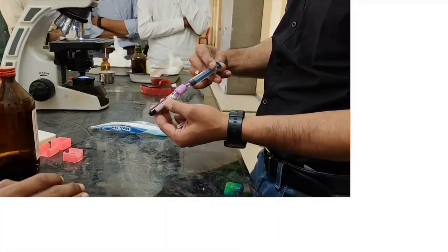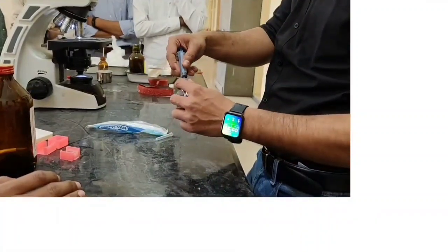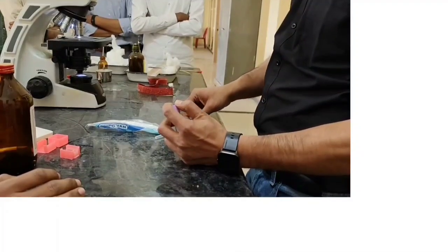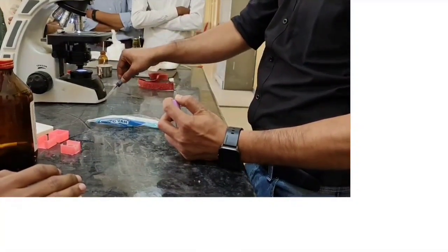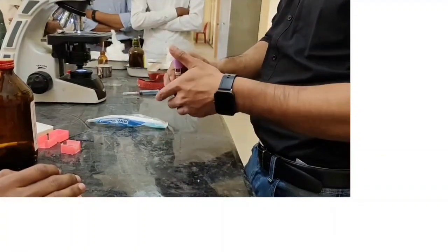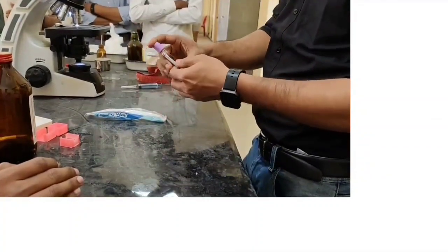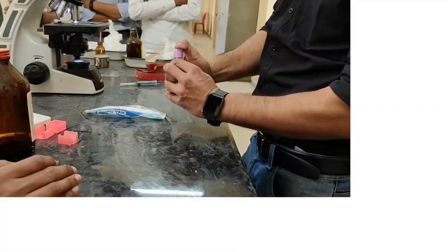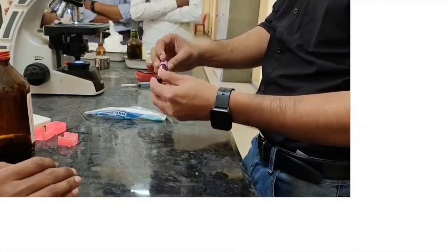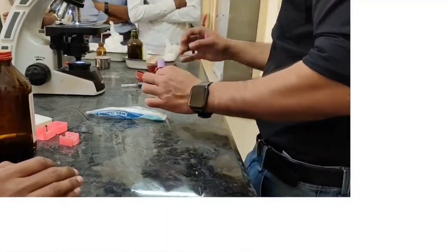If we press it forcefully, if you transfer the blood with force, then blood cells will get ruptured. So we should transfer blood very slowly. That should be the precaution. And now we have to move it once or twice up and down to mix the blood with the anticoagulant, so blood should not coagulate. I am mixing it just by slowly moving the tube.